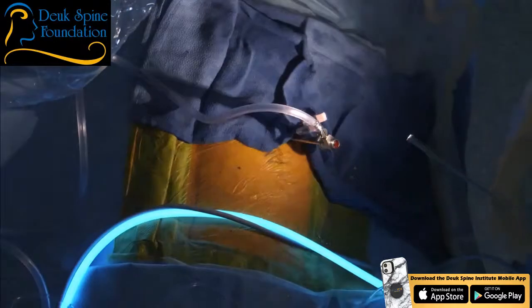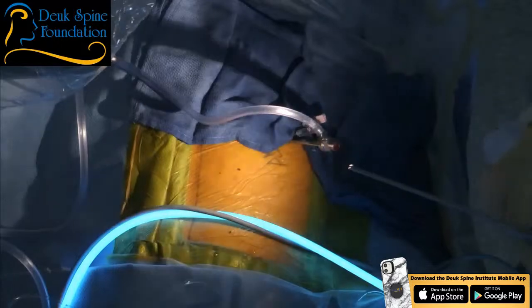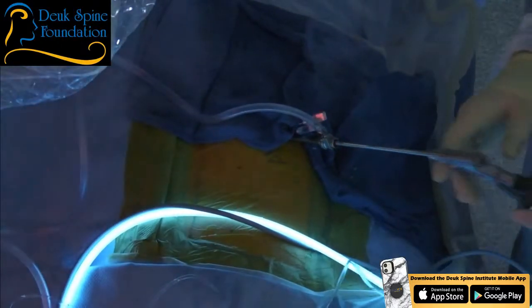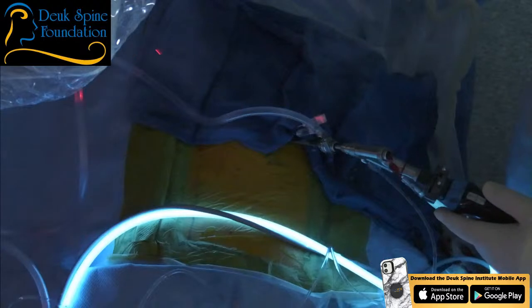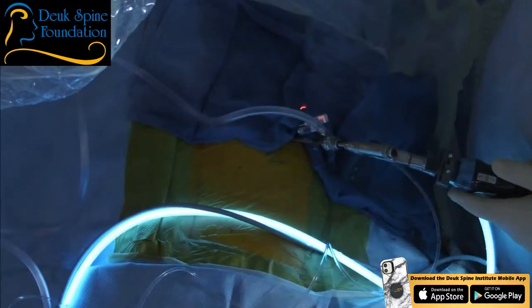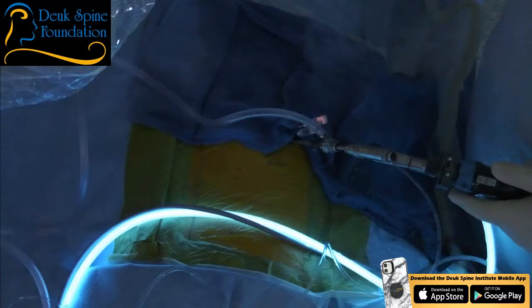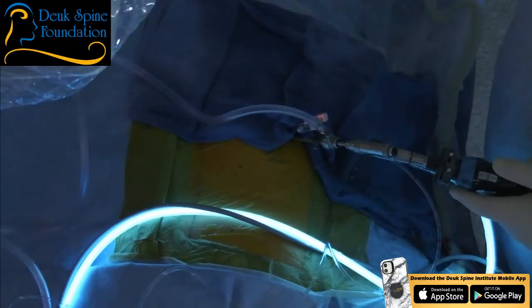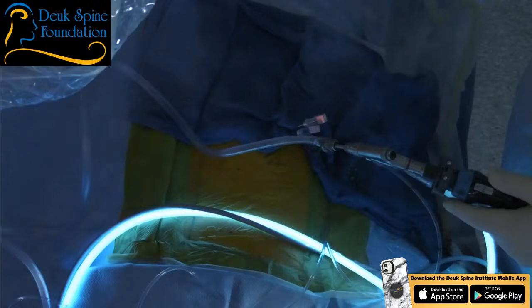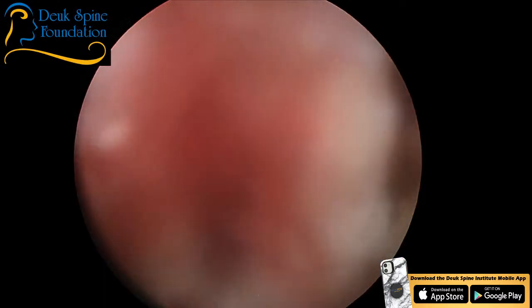I could keep going, but truth is that I'd rather have a better view. All right, so let's go down the tube, and that little venous thing is still oozing a little bit. All right, so we're inside the disc, just at the outside part of it. You can see.